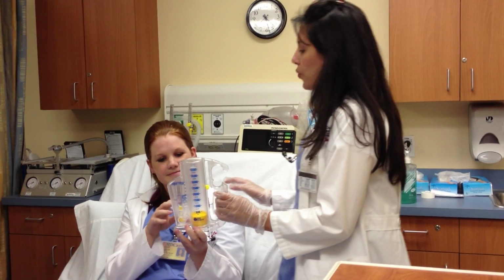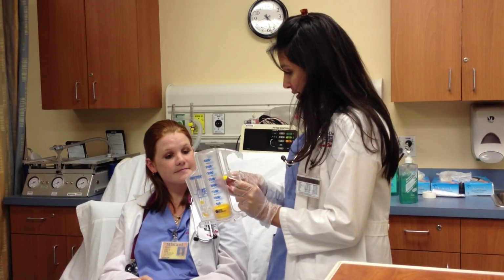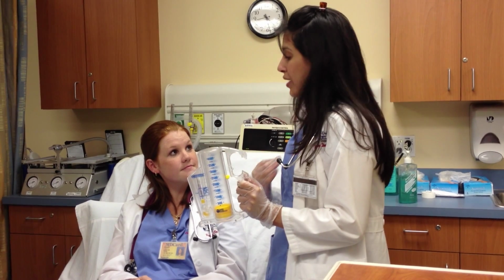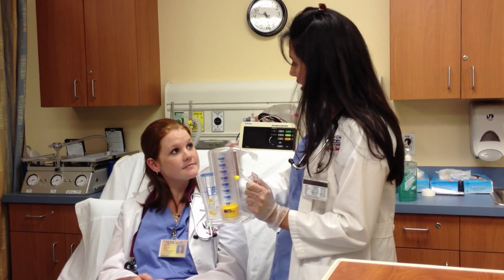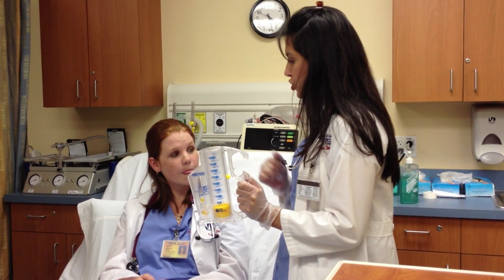Perfect. Now, remember, Krista, while you're inhaling, keep it in the happy face. When you can inhale no more, take a breath hold for 5 to 10 seconds, then exhale normally. Don't exceed yourself. Let's try that again.